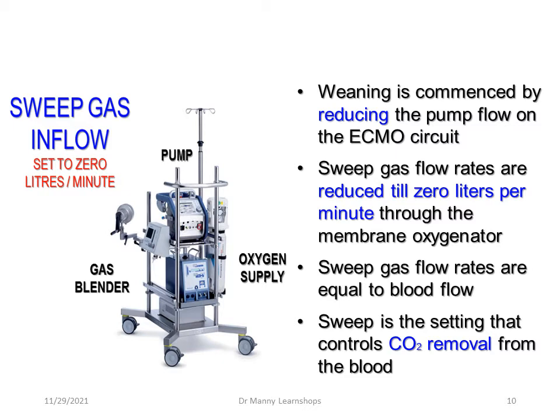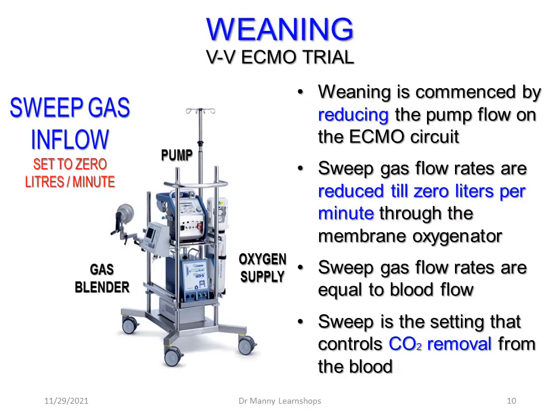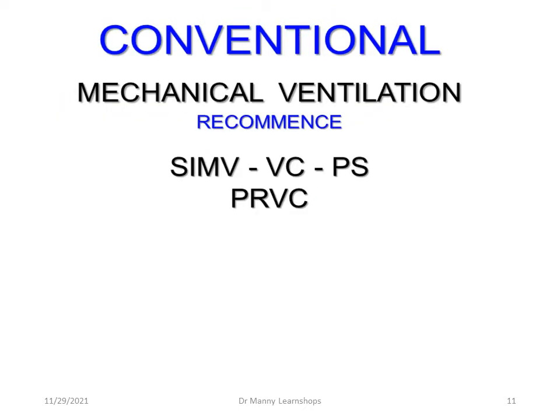When it comes to weaning as well, the sweep gas inflow should be set at 0 litres per minute. Weaning's only commenced by reducing the pump flow in the ECMO circuit. The sweep gas flow is reduced to 0 litres per minute through the membrane oxygenator. The sweep gas flow rates are equal to blood flow, so therefore the sweep gas flow should be equal to cardiac output. Sweep is the setting that controls the carbon dioxide removal from the blood. This is in your weaning process for VV ECMO.